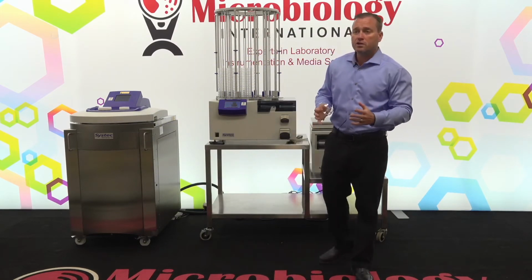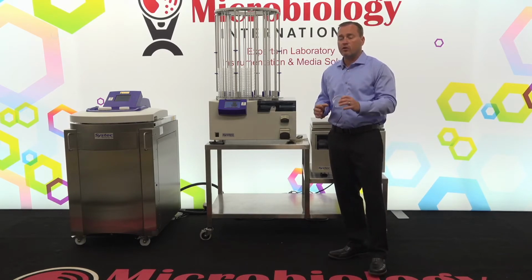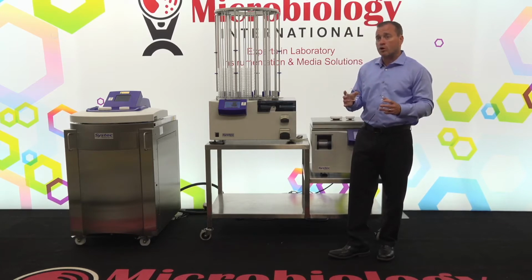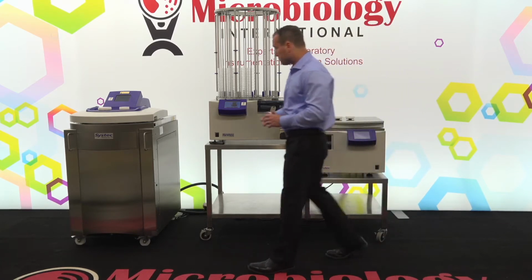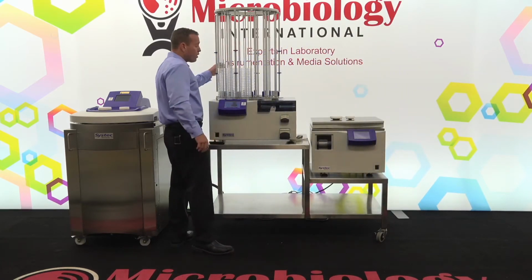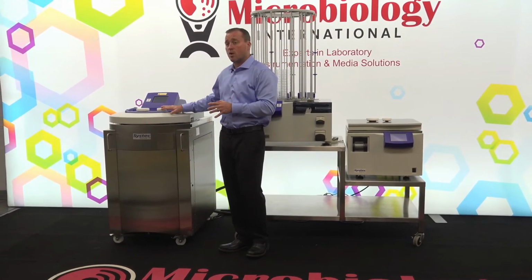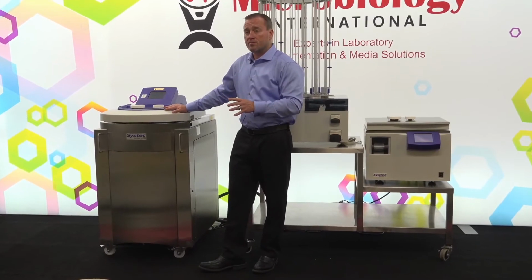So for any of the customers that are working with a deep fill plate, or any plant tissue culture customers that need to utilize more media inside of the plate, the system is already fabricated in order to be able to dispense these dishes. So just for viewing, we also have the MediaPrep 120 here today as well. This is the largest system that we offer.